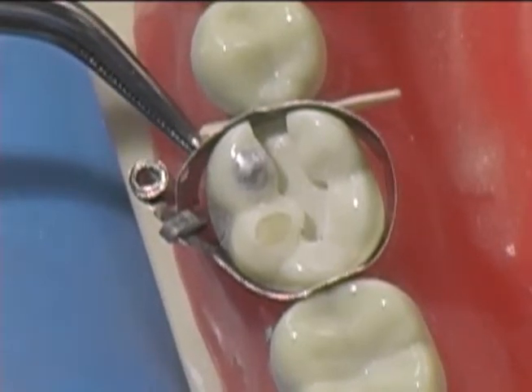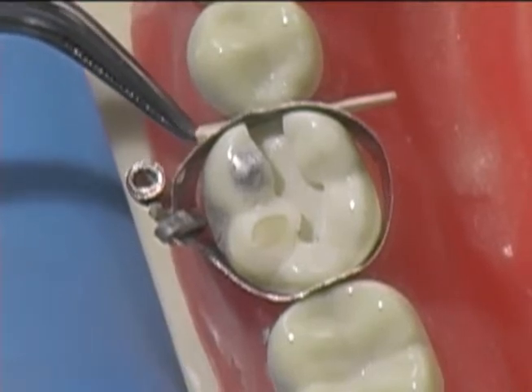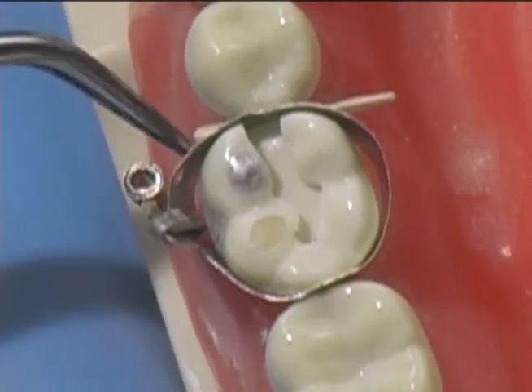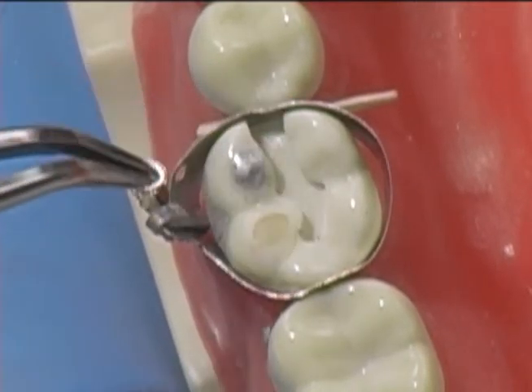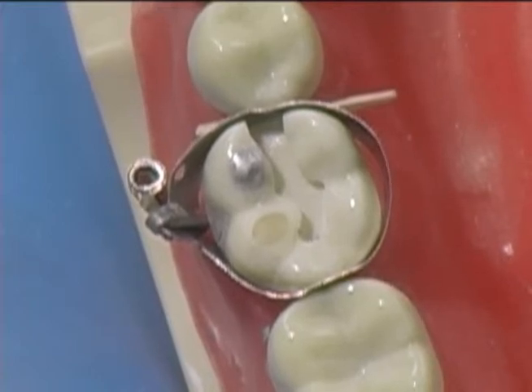The pressure in this area will help to separate slightly the two teeth, and with a little bit of flex in the periodontal ligament space, once we remove the wedge, the teeth will tend to rebound back together, compensating for the space that the matrix is taking up. This completes the placement of the wedge and the matrix, and we're now ready to place our IRM in the MO of number 19.